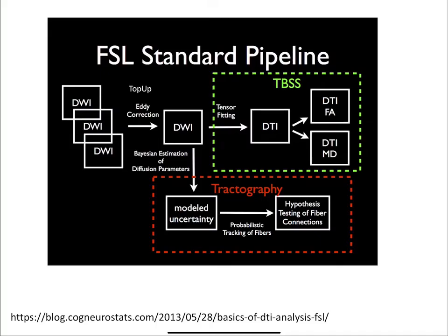Okay, so actually we're doing really well on time. So I think we'll probably be able to end on time. The last part is more about setting you up for what you will do in practice. The FSL pipeline really has two approaches. They all start off with the diffusion images, and then we'll spend some time talking about the pre-processing, topup and eddy correction. But then there are two approaches.